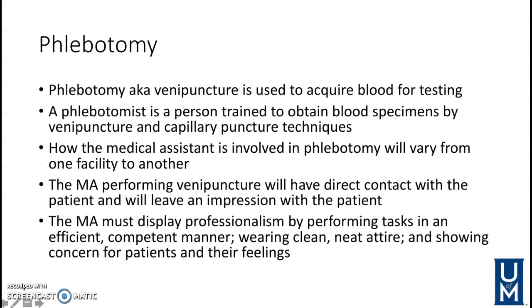So phlebotomy, also known as venipuncture, you will hear me use those words interchangeably, so make sure you understand that those are the same thing. This is a technique used to acquire blood for testing, right? So a phlebotomist is a person that's specifically trained for obtaining blood specimens.